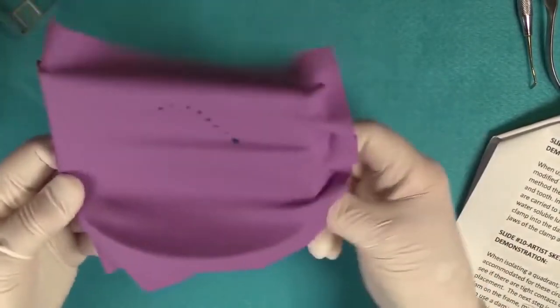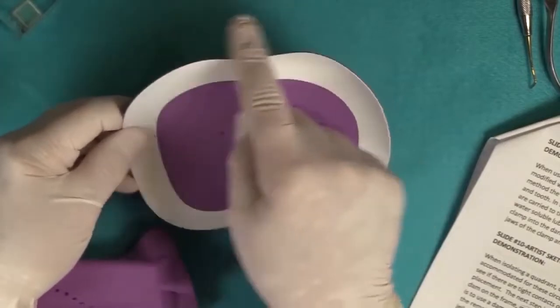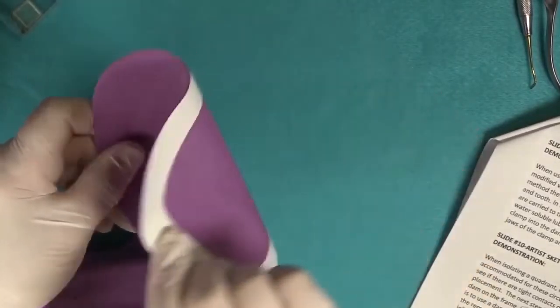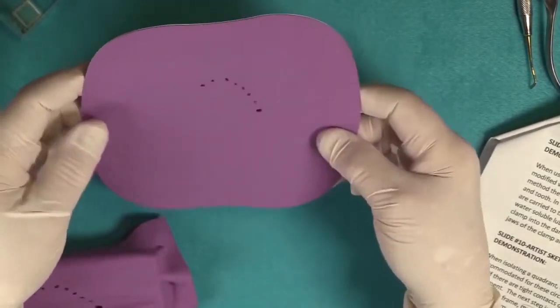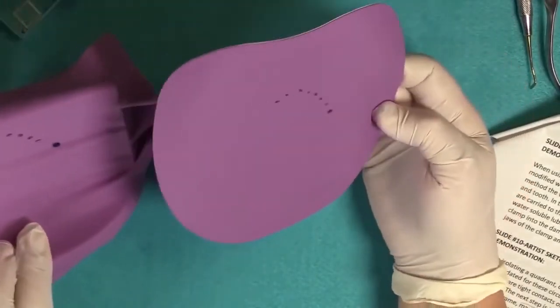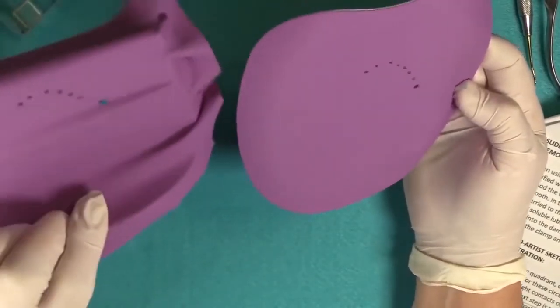Now, you have the option, if you'd like. We have also the framed Flexidam. Now, with this particular dam, it has an integrated frame. The curve goes by the nose. This is the top of the frame, and this goes by the chin. This is particularly nice when you're doing endodontic therapy because the frame is flexible enough. You don't have to worry about removing a frame to take your radiograph. So it saves a lot of time, and the whole thing is disposable, so you don't have to worry about sterilizing the frame. But in either case, either framed or this is called ready cut dam because it's pre-cut, will work.